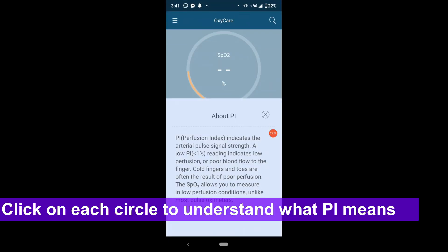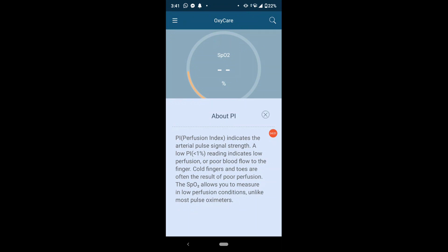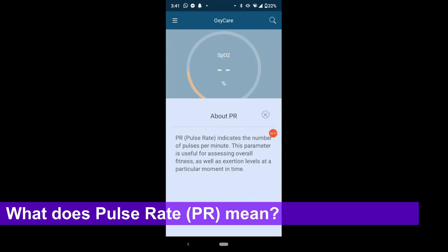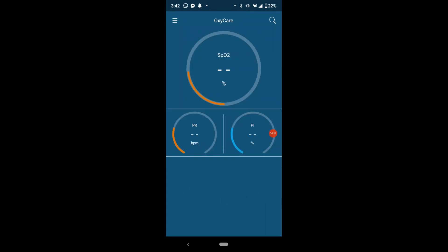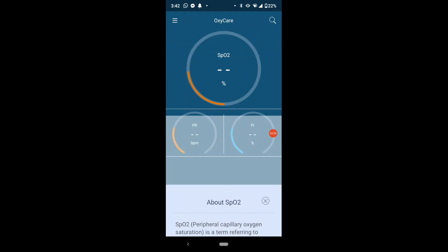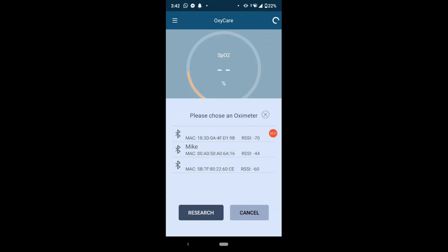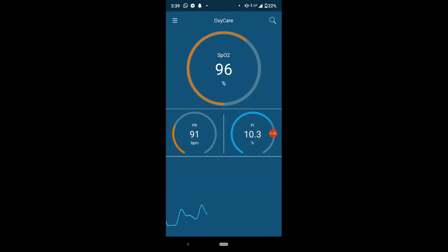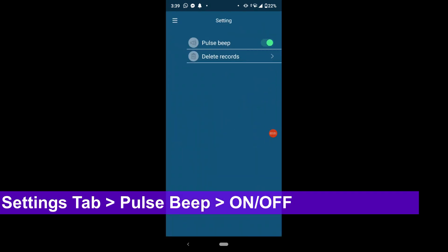Clicking on each of the circles gives you a brief description of what it means and what is deemed to be a healthy pulse rate, SPO2 level, or PI level. Pressing the magnifying glass on the right-hand side corner searches for the Bluetooth and connects with your oximeter. If you're doing the reading at night, you can switch off the beeper via the control menu option.